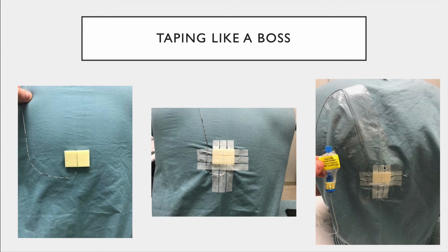After that, you'll put a Tegaderm over this, ensuring that each of the borders of the Steri-Strips are covered. You will run the wire up over the patient's shoulder, introducing Tegaderms as you travel up along the way. You will put the sticker on the filter that I was referencing, and here's the cap attached to the epidural catheter, and then you will put a Tegaderm over this entire part. And this is a complete taping done correctly.